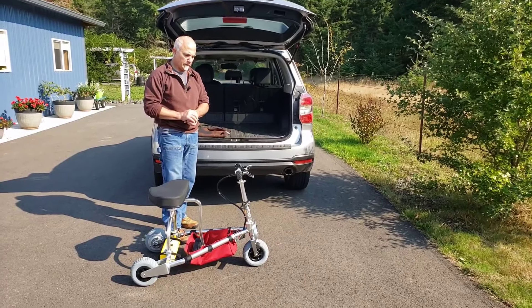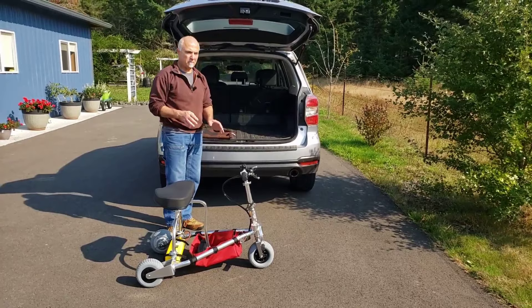The TravelScoot is the world's lightest mobility scooter. Even so, it weighs about 35 to 36 pounds, which is still a substantial amount of weight for many people.